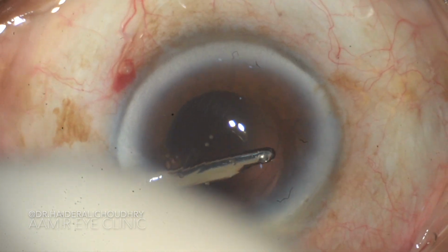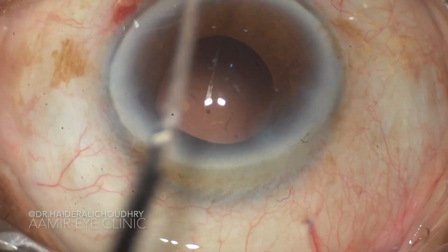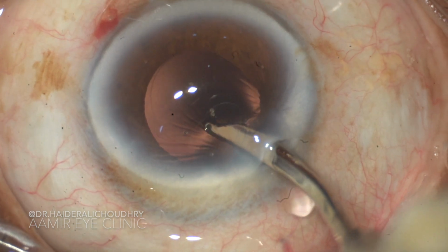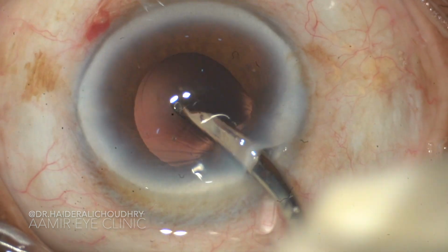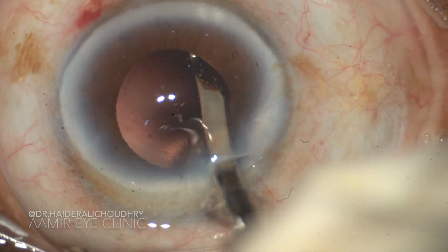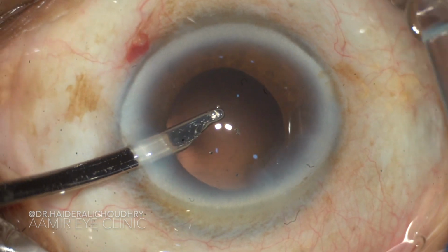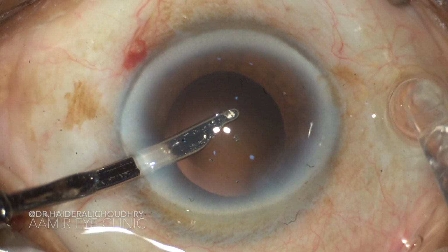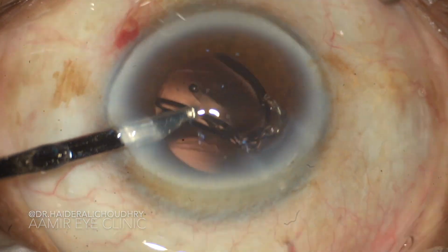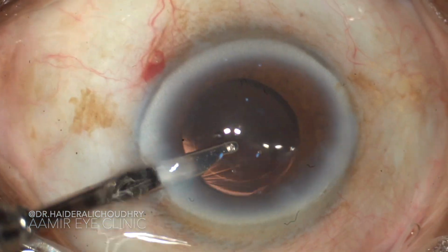It is particularly important in patients with thick arcus to keep a close eye on the nuclear fragments while you perform the phacoemulsification. A chattering of the nuclear fragments can cause some of the fragments to get lodged into the anterior chamber angle, and you might miss those fragments during the phacoemulsification and cortical aspiration, and those pieces may cause chronic post-op uveitis and corneal edema.